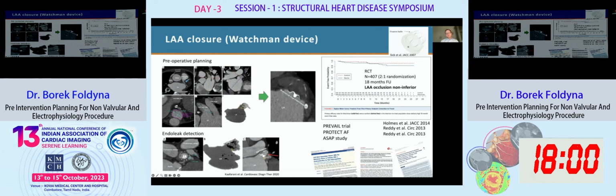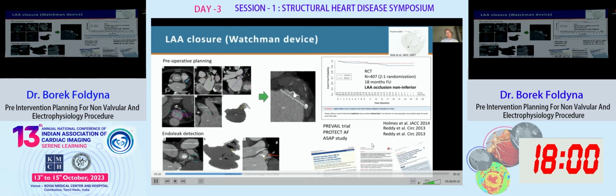Here you see that the device is not thrombosed, and we have this relatively large 9 millimeter times almost 7 millimeter para-device leakage, which connects the left atrium with the left atrial appendage. And we usually say that leakages that are larger than 5 millimeters are the crucial ones with residual cardiovascular risk and risk of stroke. That's why everybody with a leakage over 5 millimeters should be anticoagulated.